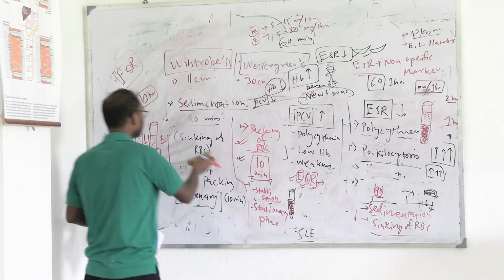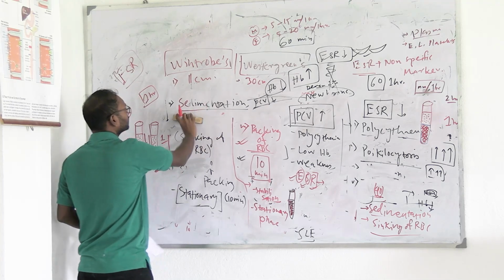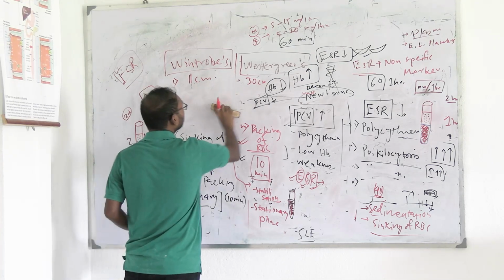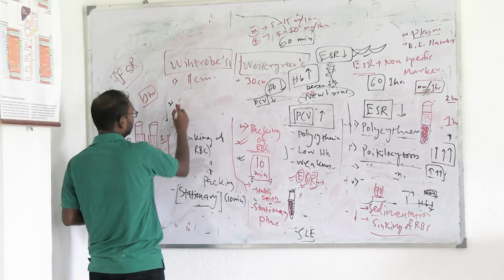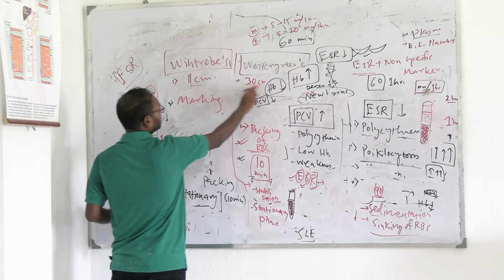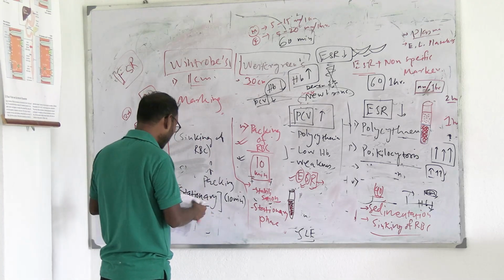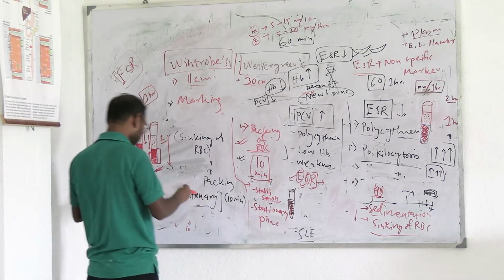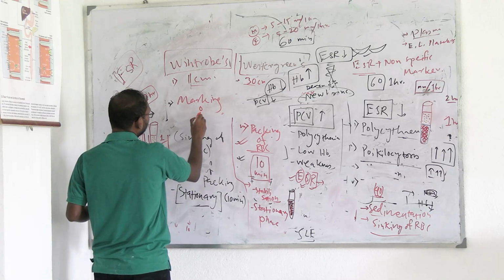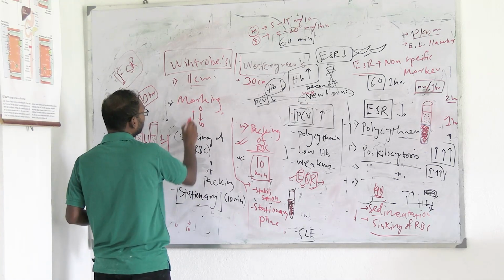Okay, now come to the third point. Third point is, sorry, the second point. Second point is marking. First was my length, second was marking. So marking in those test tubes, one test tube actually contains 0 to 10 marks on either way. It happens on this side, and on this side too.